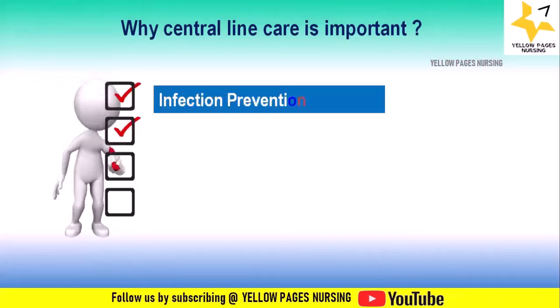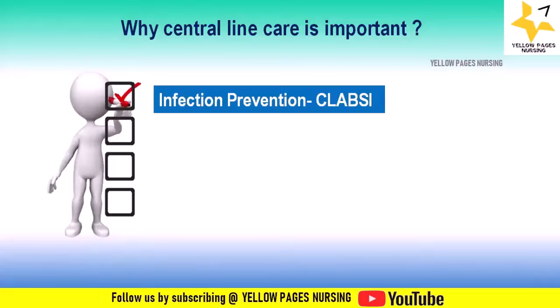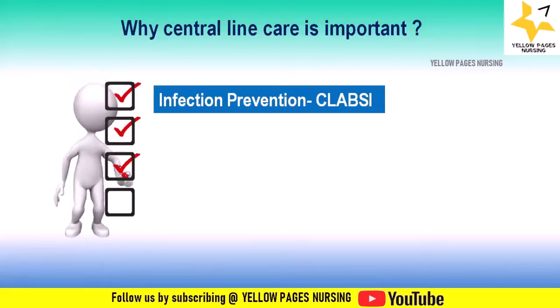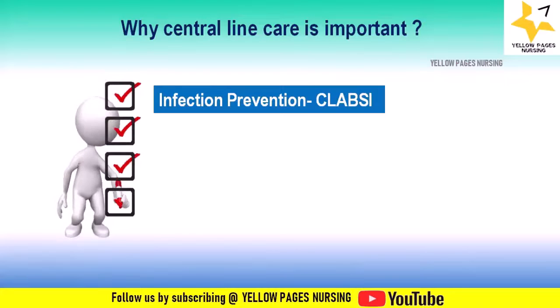First one is infection prevention. Proper care is essential to prevent central line associated bloodstream infections, that is CLABSI, which can lead to serious complications, sepsis, and increased patient morbidity and mortality. This includes the CLABSI care bundle.